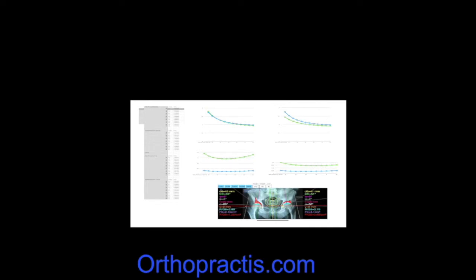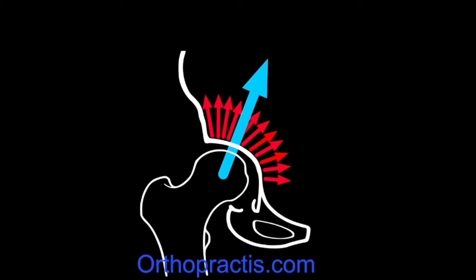4. If the load and pressure are increased, and the percentage pressure increase is greater than the percentage increase in load, a pelvic osteotomy should be performed in conjunction with a proximal femoral osteotomy. 5. Valgus osteotomy is considered necessary to obtain a congruent joint. It must be determined whether or not the resulting load increase can be compensated for by increasing the weight-bearing area of the joint so that the pressure per unit area is diminished.